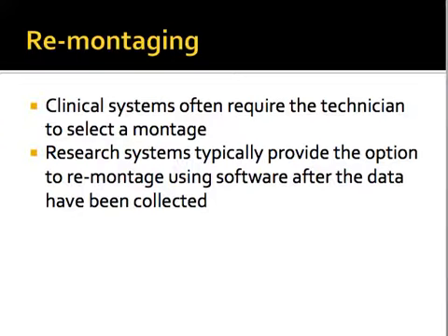So there's been some research on whether the montage makes a difference. Does it make a difference in what? Well, what are we using the EEG for? If you're using the EEG to localize something like a seizure or seizure activity, then yes, the montage can make a difference, and the bipolar, or the transverse, is often the best one because then things show up in a more localized way.